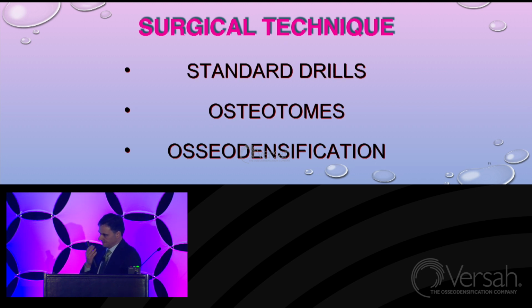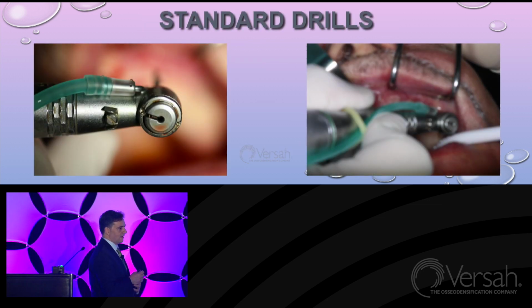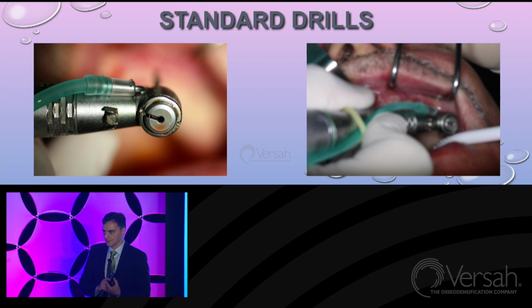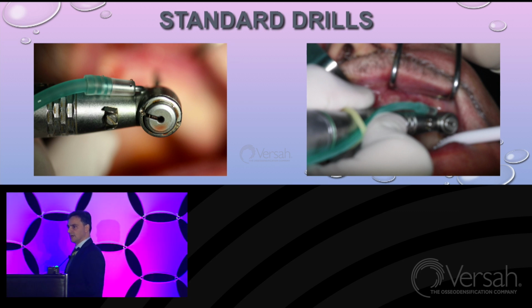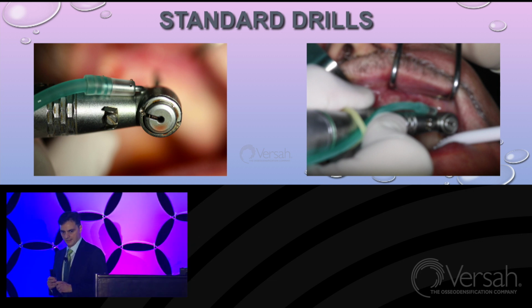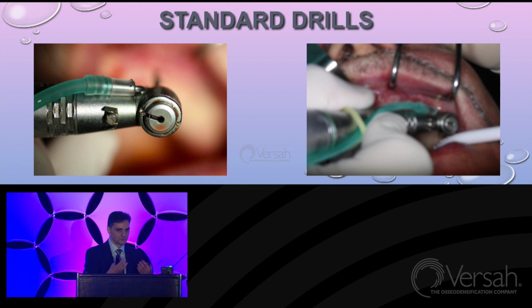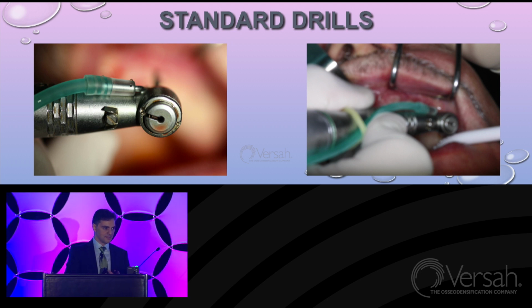Let's make a short trip on what we know about standard drilling. Like Dr. Coelho said this morning, we have a total lack of information about standard drilling. That's true, I agree with him. We have information about piezo surgery healing. We have some papers on that. But piezo surgery preparation for the implant site is time consuming. It's not yet ready for daily practice, even if piezo surgery preparation can speed up and improve the healing.